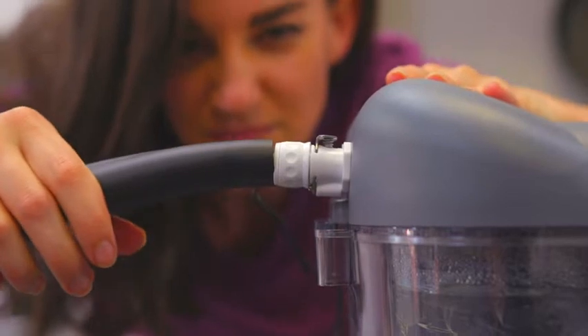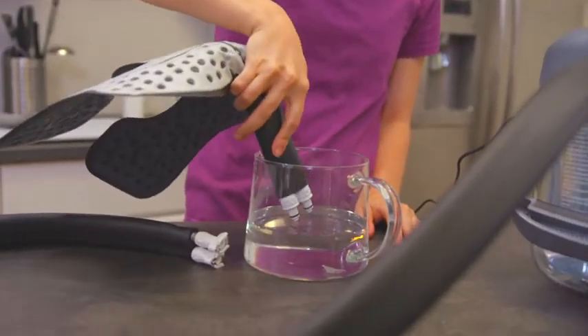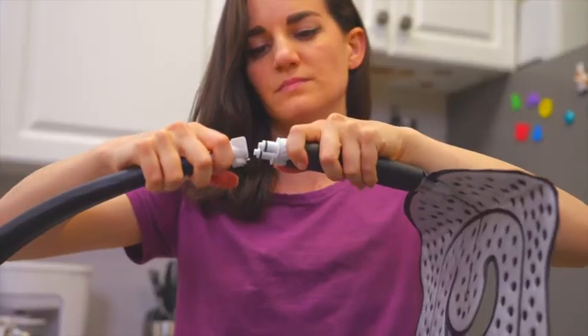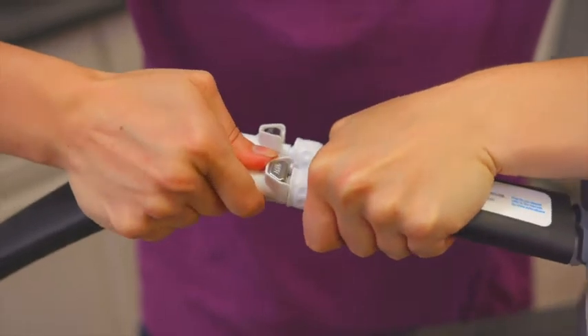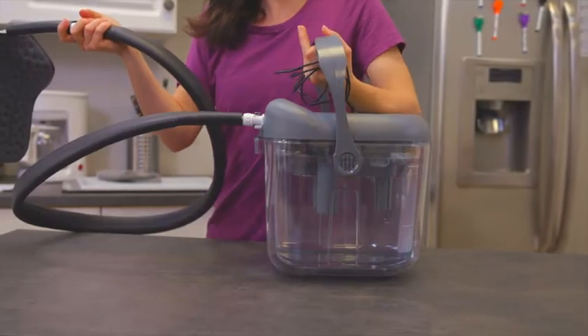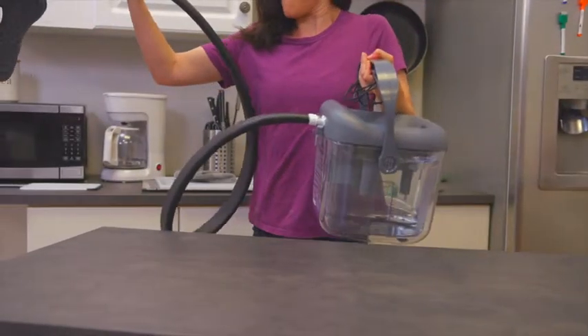Then connect the therapy pad in the same manner. Slightly wet the nozzles and ensure each valve is unlocked by pressing down on the metal lock at the top of each valve. Make sure the nozzles are both pushed all the way in and that the lock has clicked into place. The device is now ready to create a constant flow of cold water from the reservoir to the therapy pad.